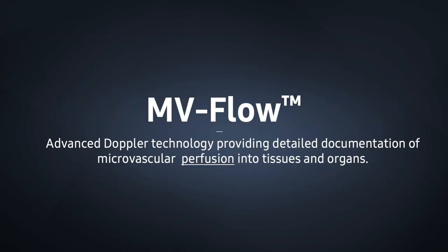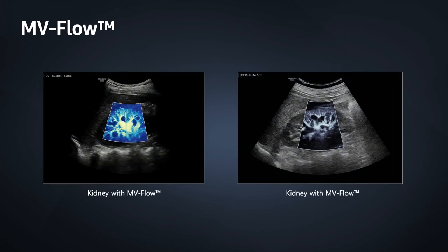MV-Flow is an advanced Doppler technology providing detailed documentation of microvascular perfusion into tissues and organs. Sophisticated spatial filtering differentiates slow-moving blood flow from adjacent tissues for more confident display of perfusion, as seen in this example depicting renal vascularity.